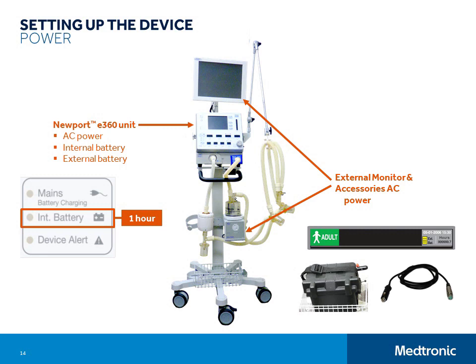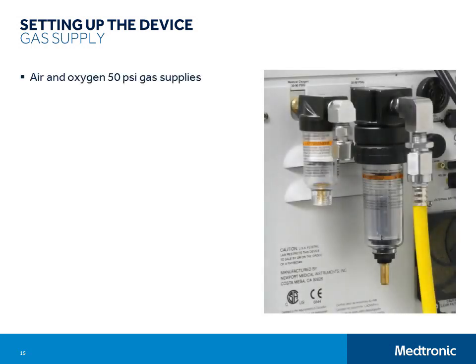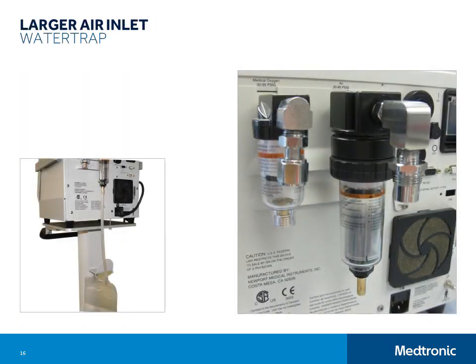Next, we'll connect the gas supplies. The E360 ventilator is designed for use with both air and oxygen 50 psi gas supplies. When ventilating at 21% oxygen, the E360 can run from an air supply with no oxygen connected. And when ventilating at 100% oxygen, the E360 can run from an oxygen supply with no air connected. The E360 is equipped with a larger air inlet water trap to help minimize the chances of water entering the ventilator through the air source gas line. This air inlet water trap comes equipped with manual and auto drain features.